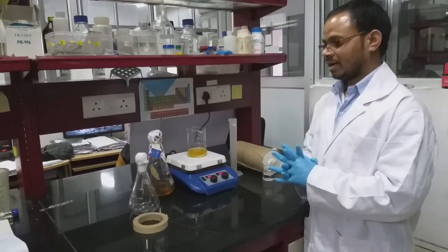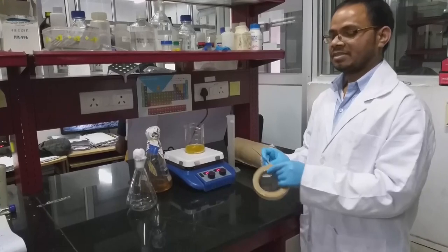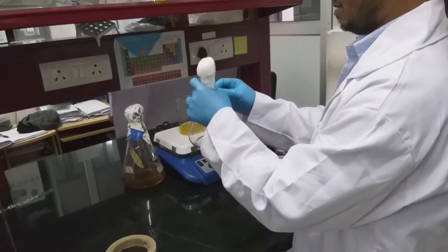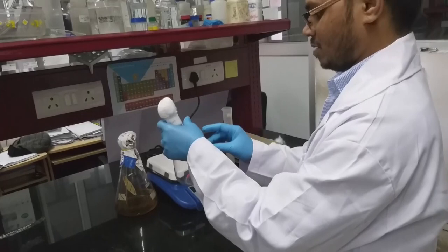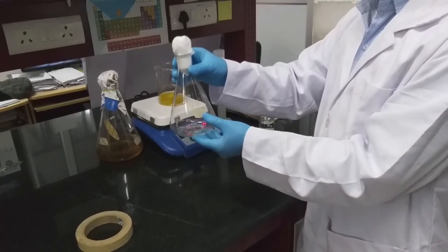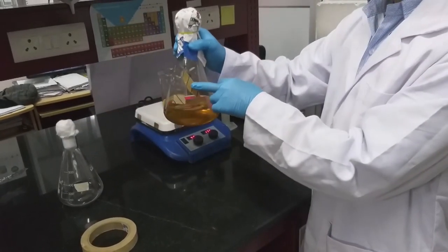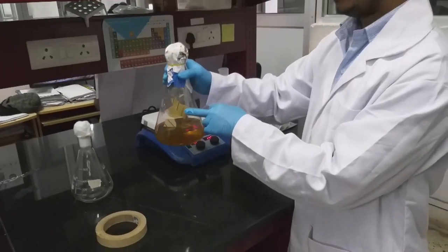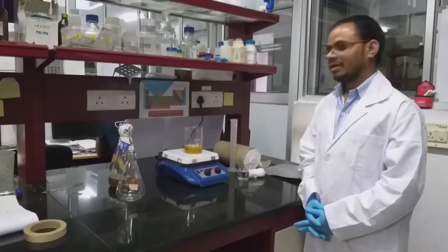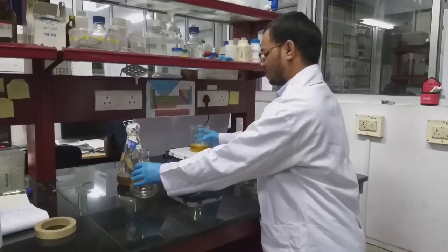In order to check whether the media is autoclaved or not, we use a sterility indicator. This is a paper based sterility indicator. We paste it onto the flask and we autoclave. If the autoclaving is properly finished, then we will see the white strips turning black. This is the indication that the autoclave process is complete. Okay. Now the media components are completely dissolved. Now we have to pour into the flask.